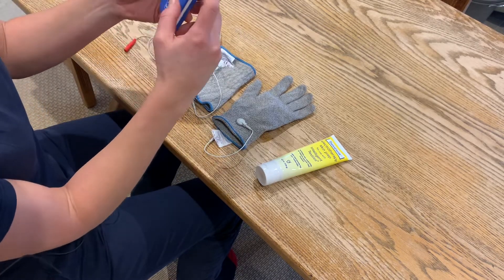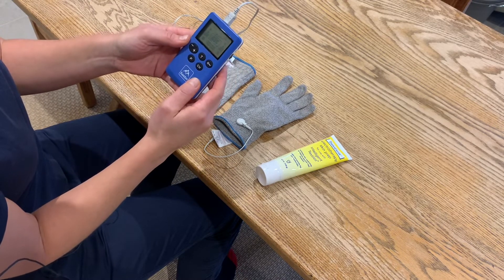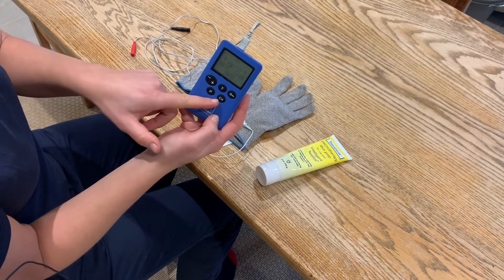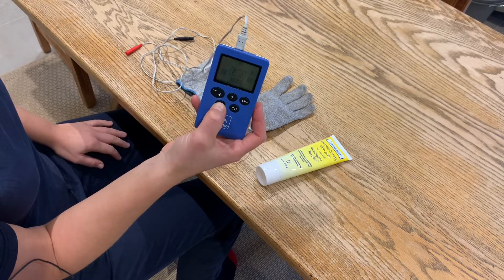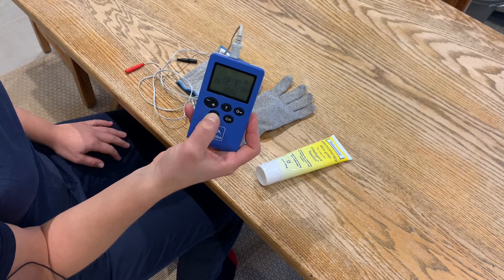Next step: switch on your device and we're going to scroll through to the program we want. Press CH until A flashes, then scroll through until you get to program 14.